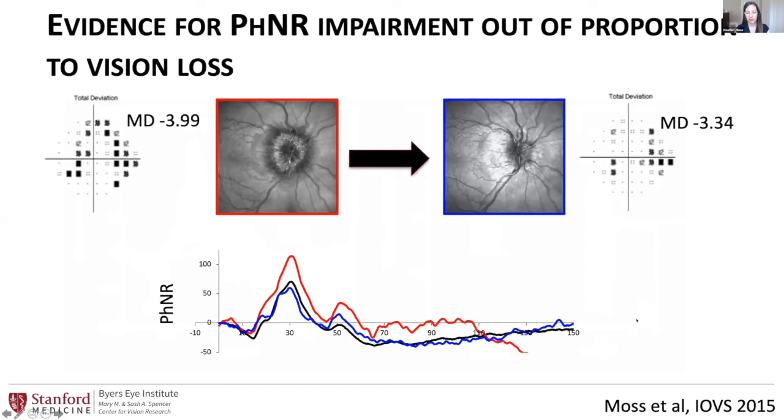This is one particular patient that I thought had a very interesting result. So her vision with papilledema is shown on the left here. And in her pre-treatment ERG, you can see that the photopic negative response is not very robust compared to the normal in black. With treatment, her vision actually didn't change that much, still showing a mild visual field loss on the right, but the photopic negative response improved. And so this offers the question of whether some of these electrophysiology tests might be able to anticipate ganglion cells that are at risk of losing vision, and with aggressive treatment, one might save, so to speak.